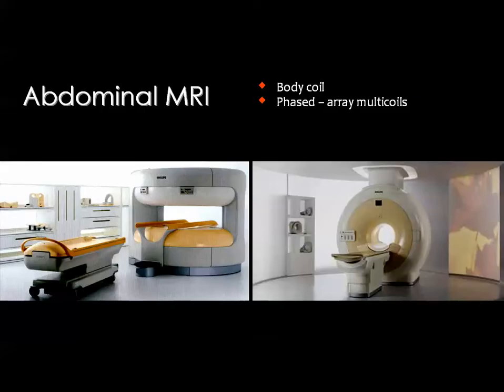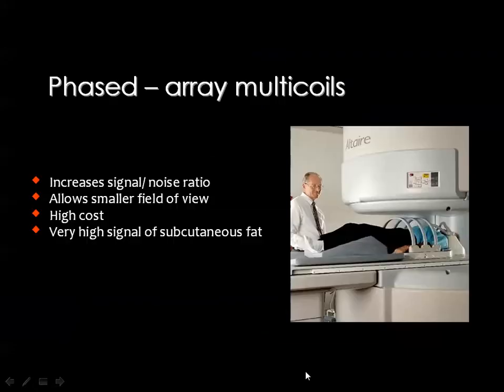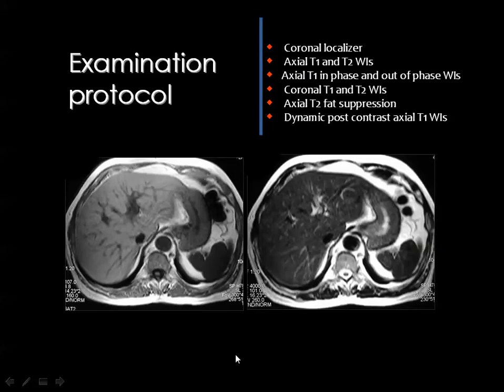because we will expose the importance of MRI in the abdomen whenever we are evaluating specific organs like the liver, pancreas, and the kidneys, and so on. Then in order to examine the abdomen by MRI, you should have the surface coil, and the phased array coil is one of the important coils which are used for abdominal imaging.